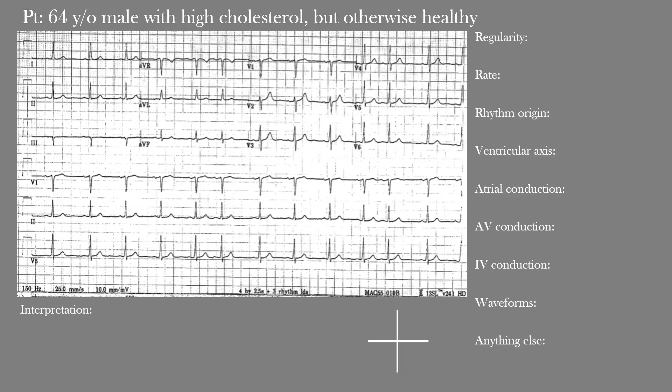Before we get started, let's review our approach that we've been using to interpret EKGs. We have the patient's clinical presentation above, and below it we have his EKG. On the right side you can see the list of areas we're going to go through. First is regularity — whether the rhythm is regular or irregular, and if irregular, whether it's regularly irregular or irregularly irregular. Next we have the heart rate, and then we'll look at the rhythm origin.